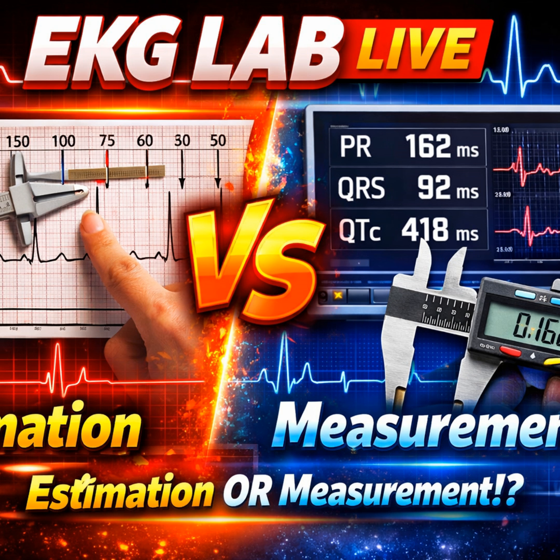I find that line of reasoning risky because it relies on the clinician noticing a subtle physical sign, which is notoriously prone to error. You are replacing one difficult observation with an even more difficult one. The grid does not lie. If the boxes say the PR interval is constant and a beat is dropped, it is Mobitz 2.